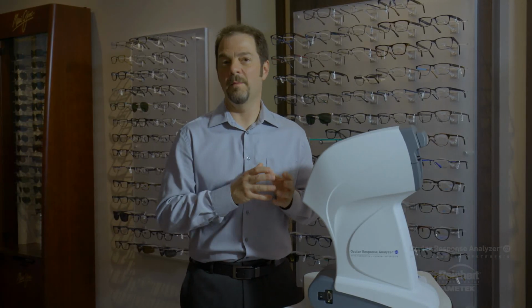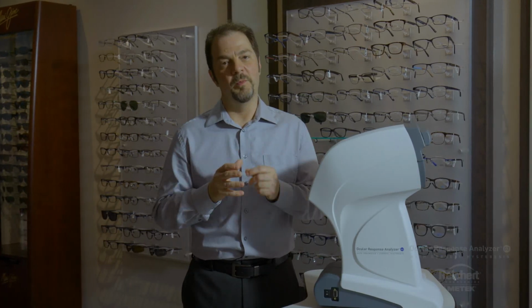Another possibility is that, remember, Goldmann is subjective. The clinician decides what the pressure is with a Goldmann tonometer based on their experience and their technique. But two different Goldmann operators are going to give two different answers in many cases for the same patient eye at the same point in time. And so when you measure a patient with a Goldmann tonometer and you get 16 in one eye, guess what the pressure is going to be in the second eye?